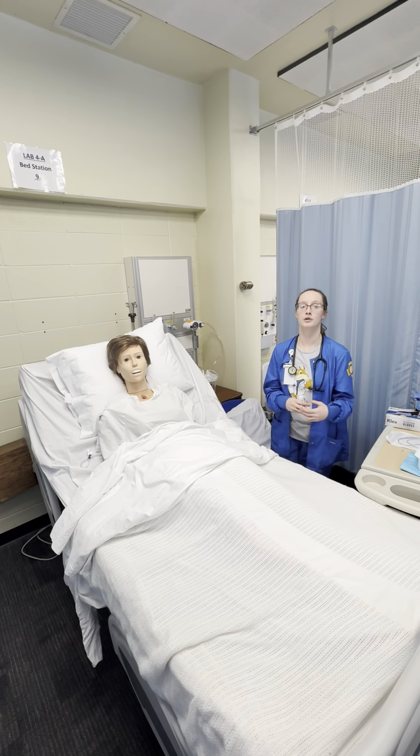Going to go from the tip of the nose to the tip of the earlobe, and then down to the xiphoid process, to the start of it. And at that point right here, I'm going to go ahead and mark that with a marker or a piece of tape.